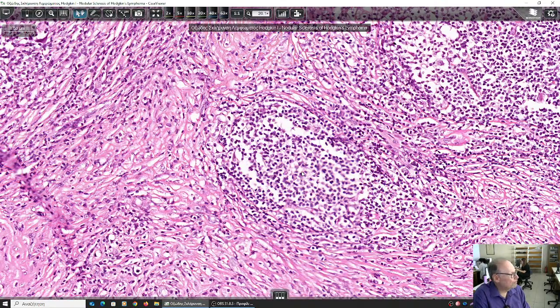What do you think this is? It is round. It has lymphocytes. Do you see any neoplastic lacunar giant cells? Neither do I. So what can this be? Who can tell me? It's easy. It's a nodular accumulation of lymphocytes. And we are in a lymph node. So what can this be? This is something of the normal structure of the lymph node that remained, that stayed there despite the distortion of the architecture caused by the nodular sclerotic lymphoma.